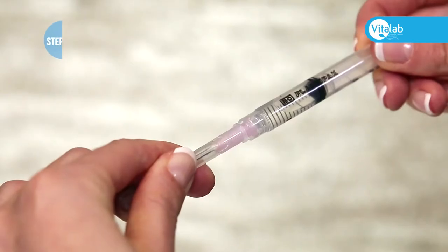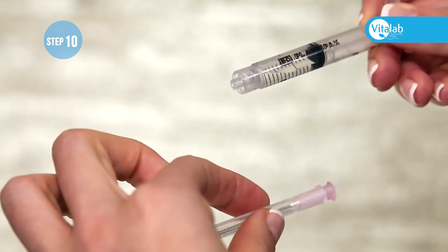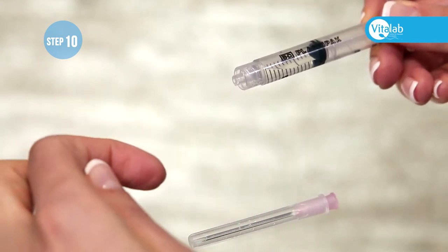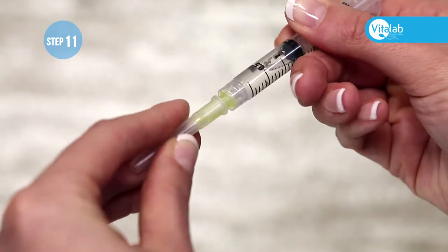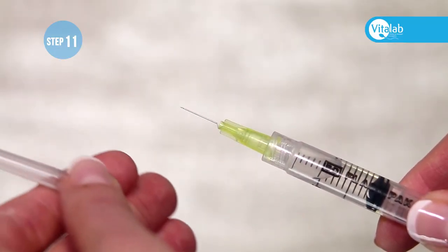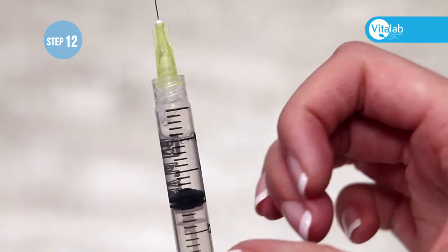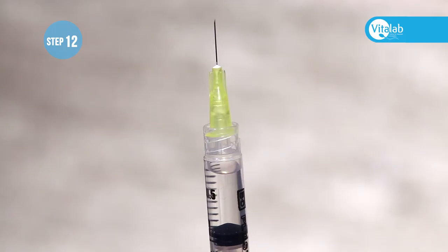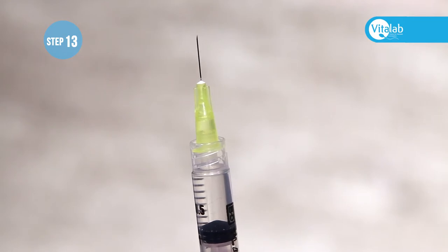At this stage, do not worry if there are bubbles in the syringe. Cover the needle with the plastic cap and remove the pink needle by screwing it off. Remove the small yellow needle from the packaging and screw it tightly onto the syringe. Remove the plastic cap, hold the syringe upright while tapping the syringe to get all the air to the top, then gently push the medication up until you see it appear in the yellow part of the needle.